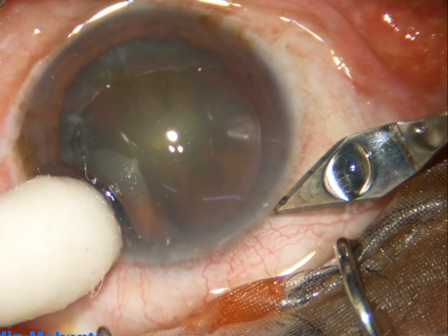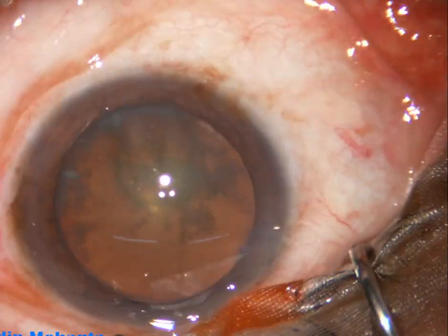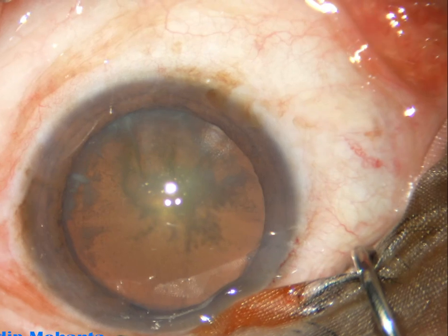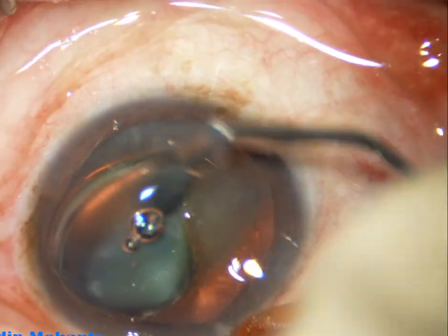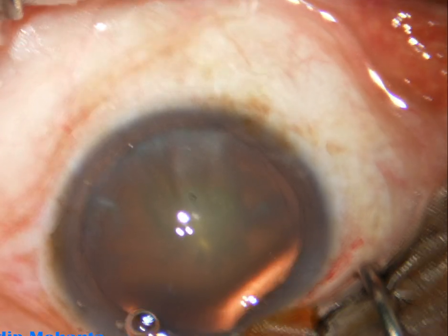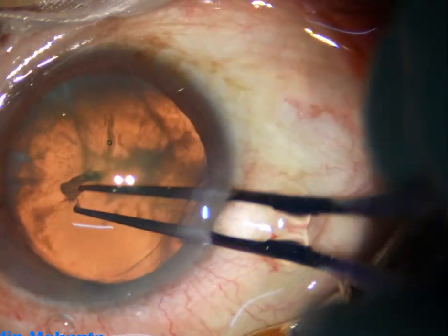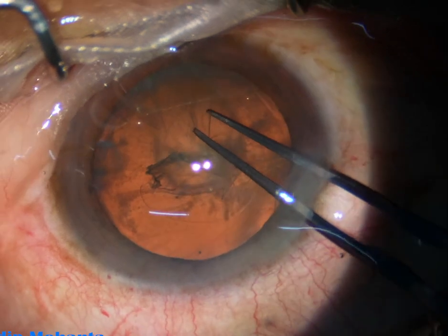Let us observe a video. This is the main incision with a 2.8 millimeter steel keratome. The anterior chamber is filled up with two percent hydroxypropylmethylcellulose. The patient is under topical anesthesia. This is a side port on the left side of the main incision.